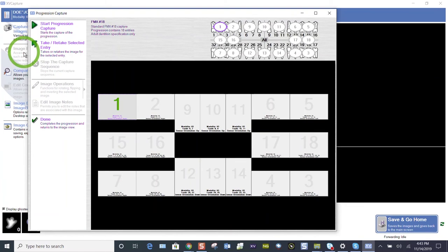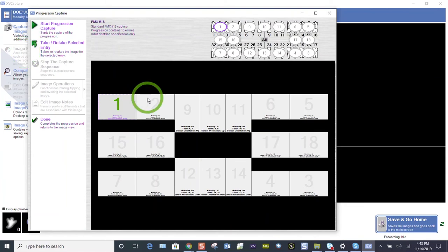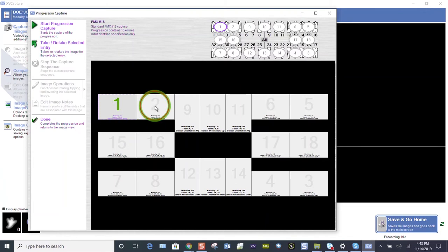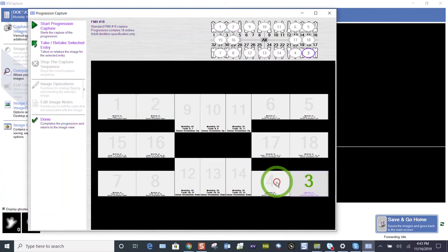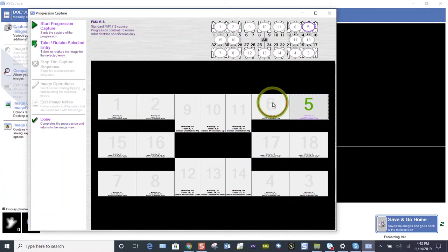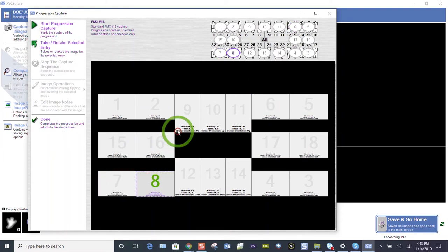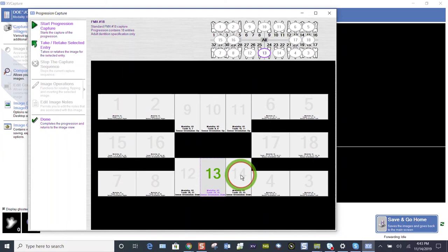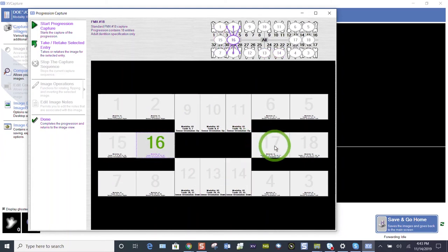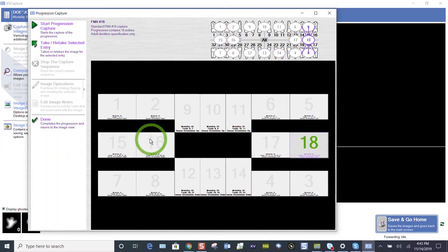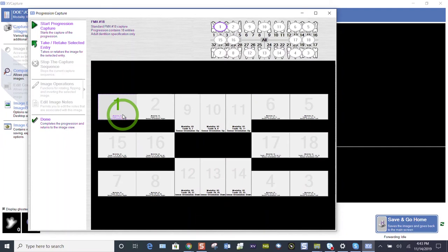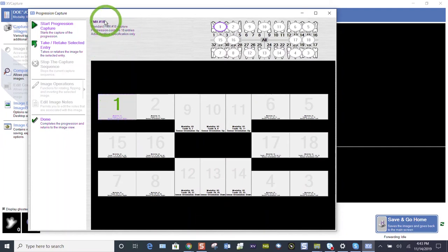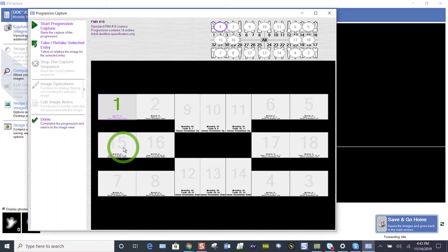This is the most tried and true as far as time efficiency and taking an FMX 18. Starting on the upper right, you see the numbers on the tile. It's going to move in that numerical order and then anteriors. And it takes the bite wings last. However, if you like to take your bite wings first, the layout will always start on tile one. You see the name of the layout here in the upper left. If you want to do your bite wings first, that's great. Do those first.